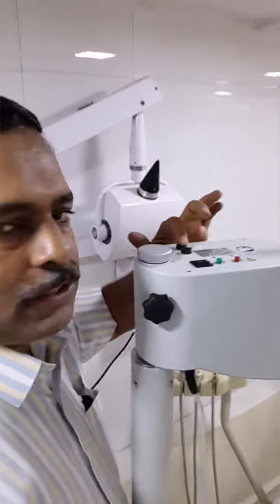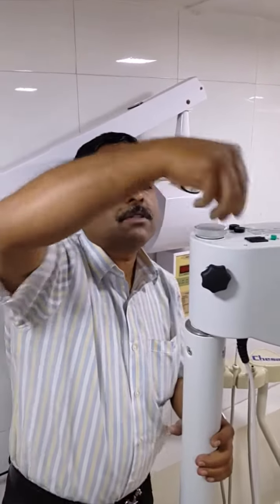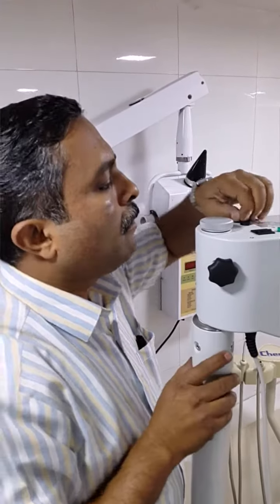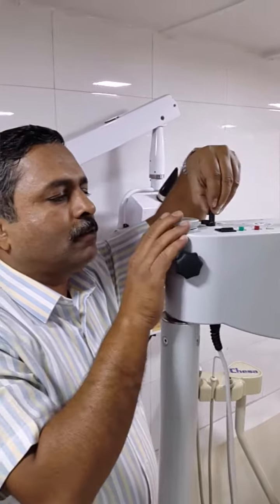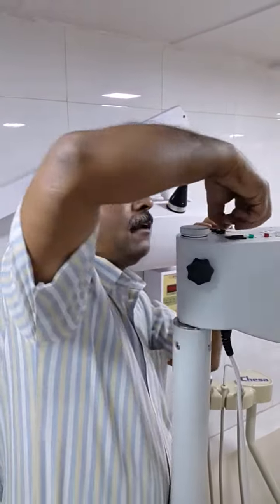Besides this, there are two fuses. How to remove the fuse — do not use any screwdriver. One ampere fuse. There are two fuses. While fitting it, press it and then turn to lock.